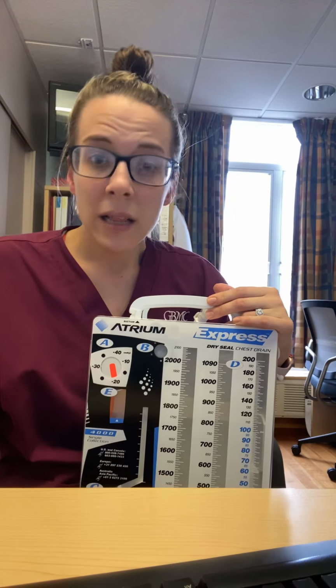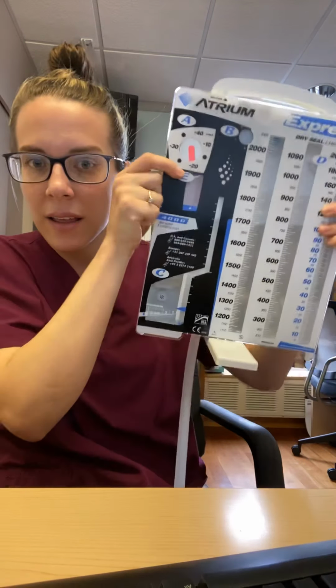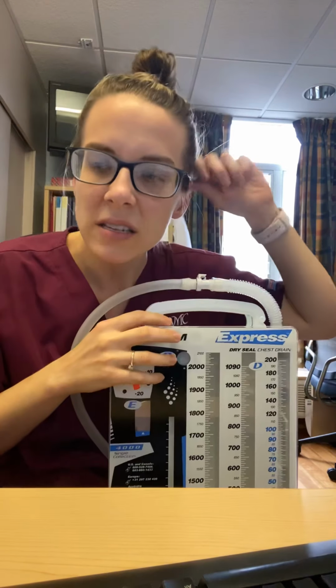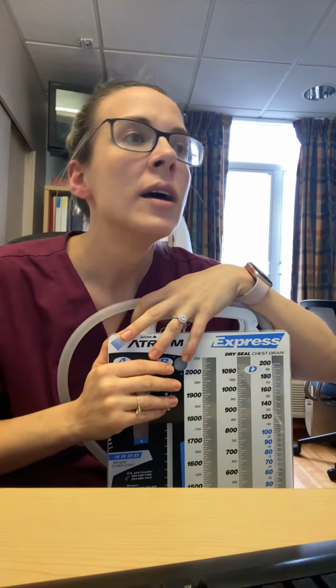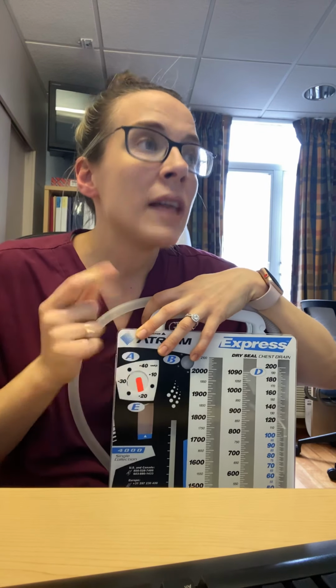All right, now we're on slide 11. These are two different types of mobile devices. You can see this thing is huge, but if a patient has had a small pneumothorax or a small air leak for a week and says, I need to go home, I can't do this anymore, sometimes the surgeons will say, okay, switch them over to a mini Atrium or put them on a Heimlich valve. On the left is a Heimlich valve.